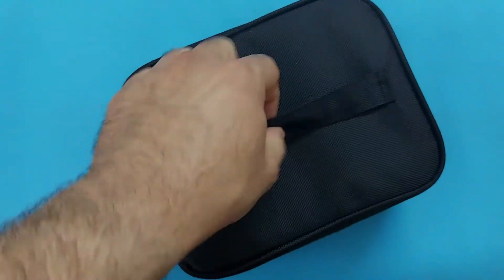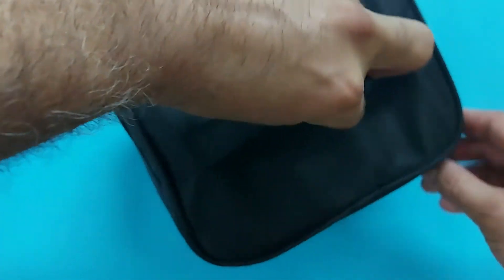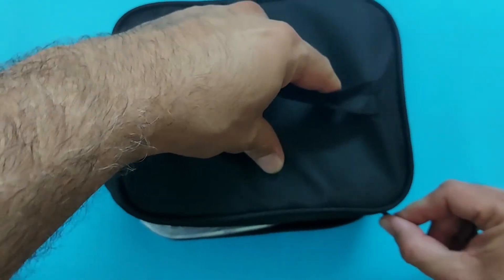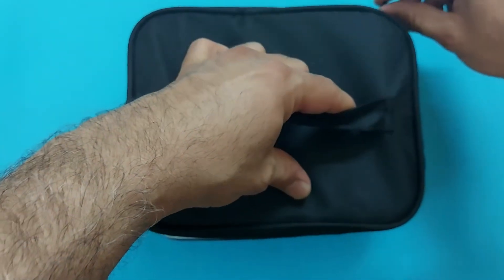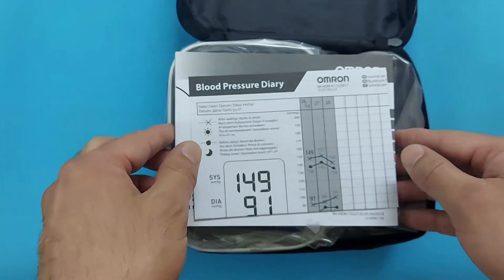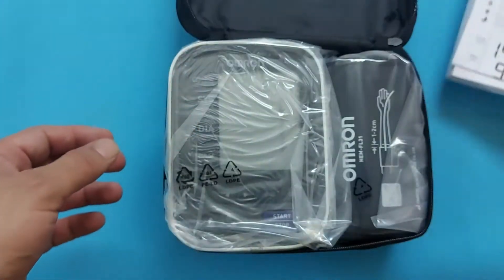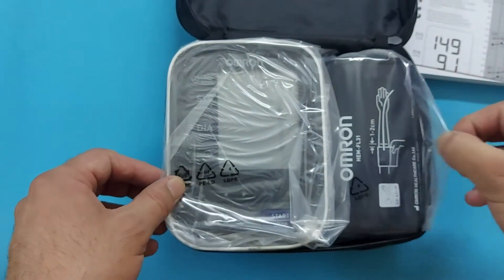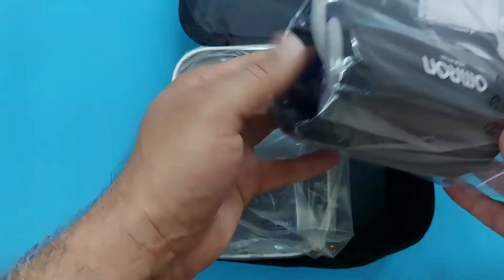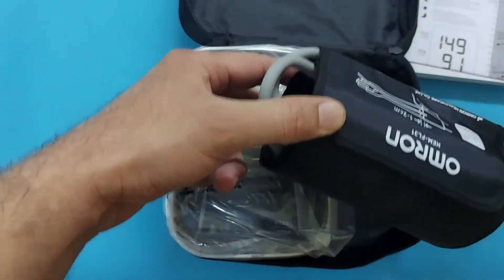Let's open this carry box. The device is inside with some components, so you should know how to fix it. These are the booklets — you have to read them well before making settings in this device and before measuring blood pressure. And if there are any errors in your device, read these booklets and you can make corrections for those errors.